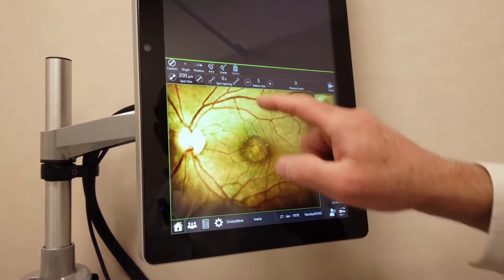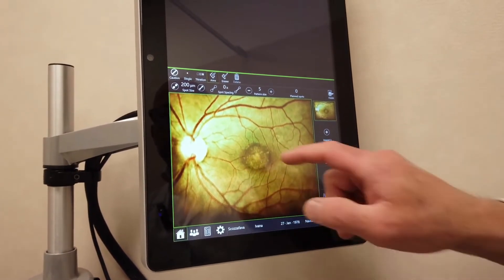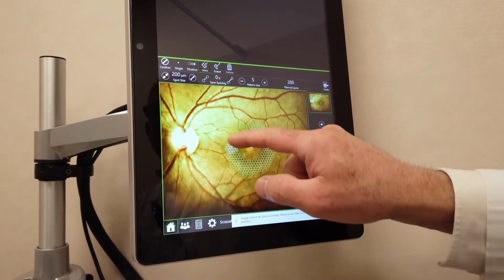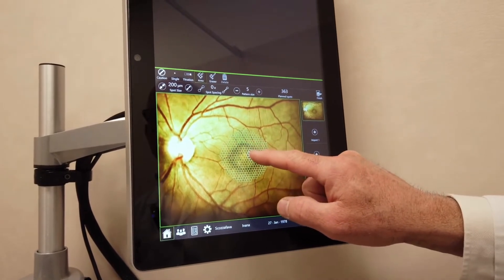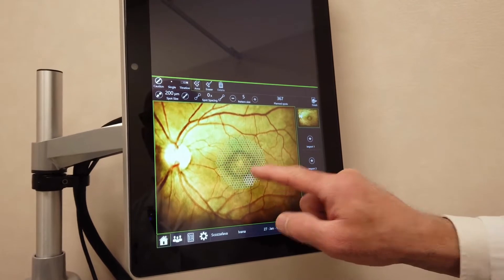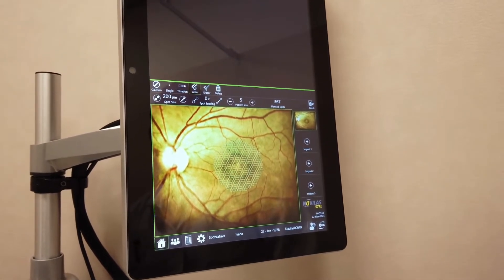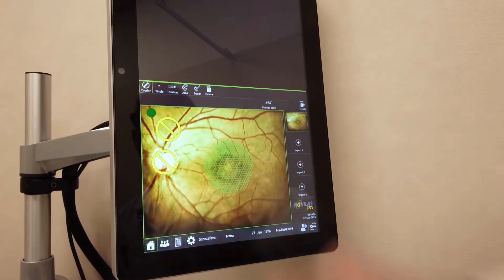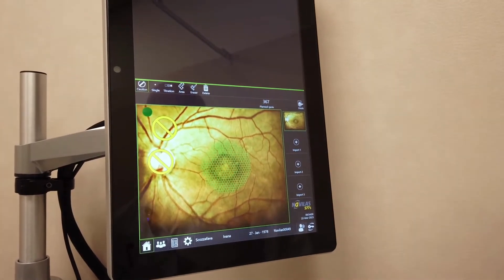These are the parameters, after which we start to draw on the retina the area we are going to treat with the system. We treat both the foveal area and extend the treatment just outside the edematous area. This machine also has two no-treatment areas available where the machine does not treat, and the surgeon chooses to activate them or not.